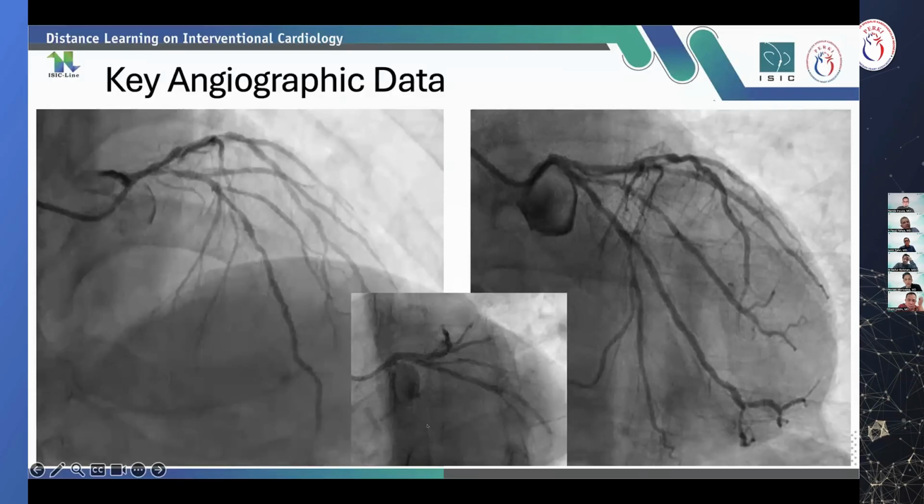Dr. Noriaki, this kind of short left main, would you still use OCT for such a kind of disease? I think OCT is still acceptable for this kind of lesion. I think we can clearly see the left main body, but as you know, the exact ostium is challenging.